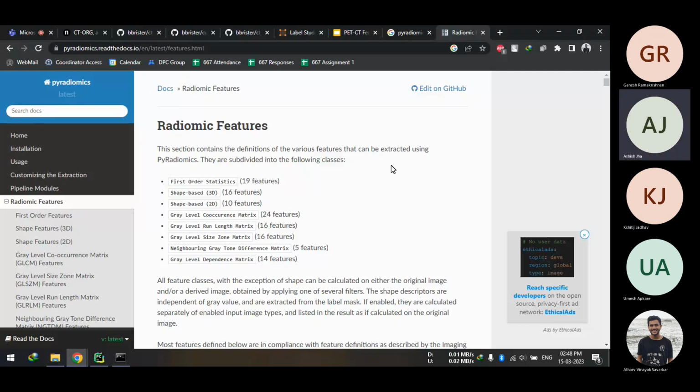So I think the first goal should be to contour that organ and then contour the tumor. Okay. And then extract those features that Dr. Hasmukh told, SUV and all, and TLG, MTV, these kinds of things. And then we try whatever we want to predict, whether it has predictability or not. If it is not, then we will go back and do radiomic analysis. No. Ashish, what we will do is, let me propose this one, right? Yeah.